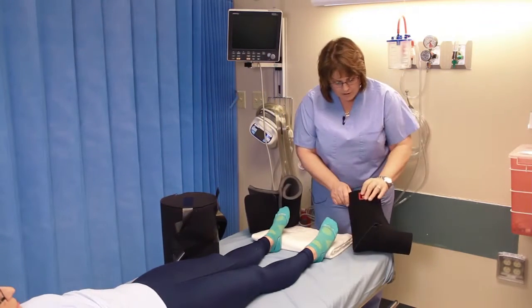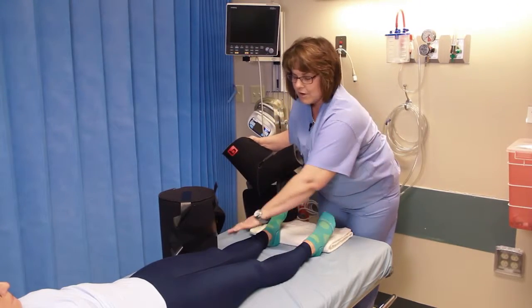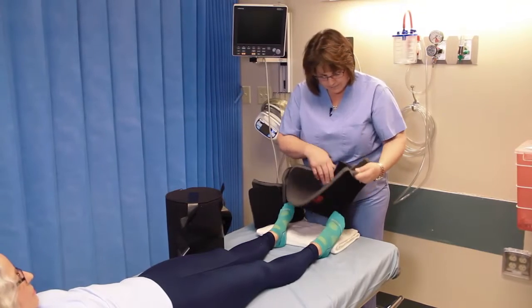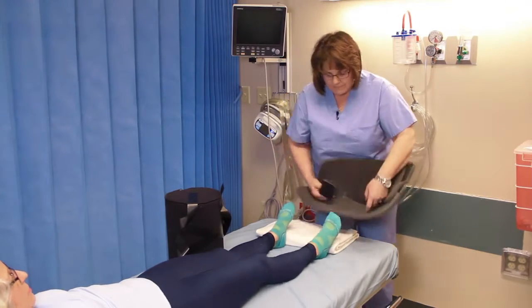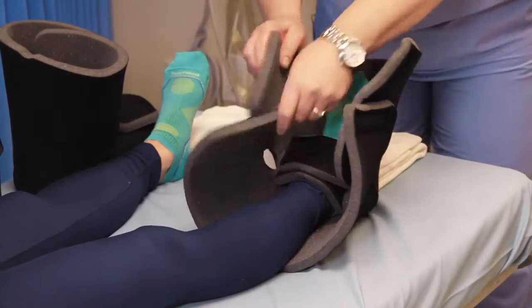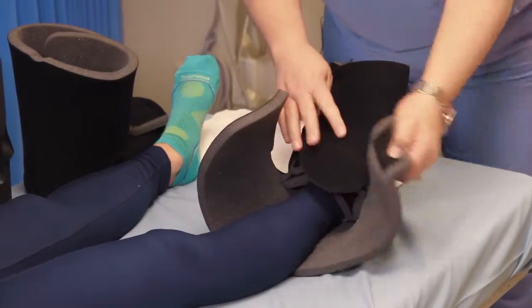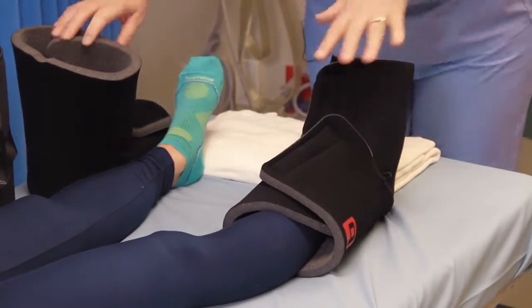The boots have a red logo and that should go on the outside of the lower leg. Lift up your leg and put your heel right down in there, piece of foam, tuck it around, secure the ankle part first, then the forefoot, and then snug on the top part.